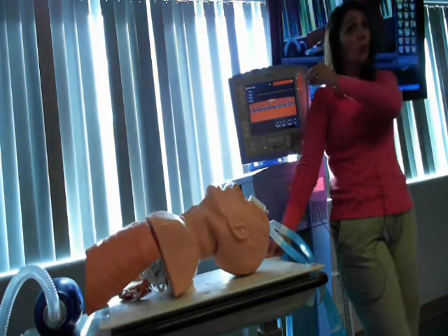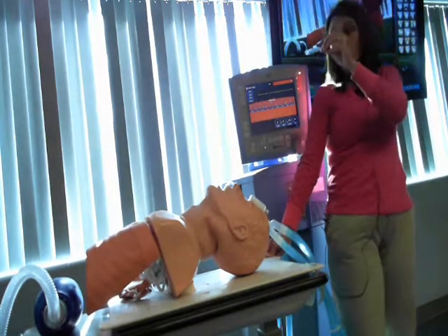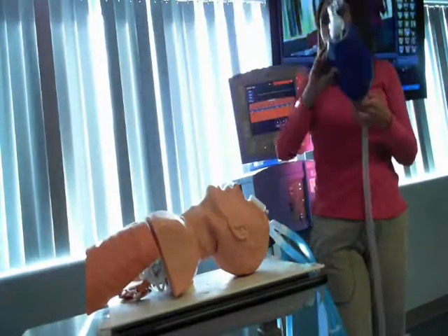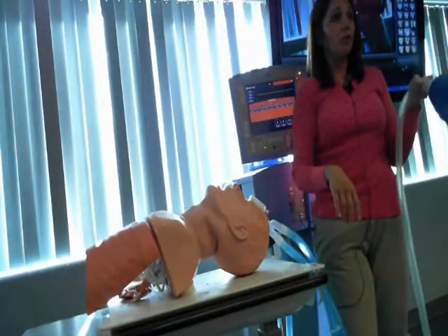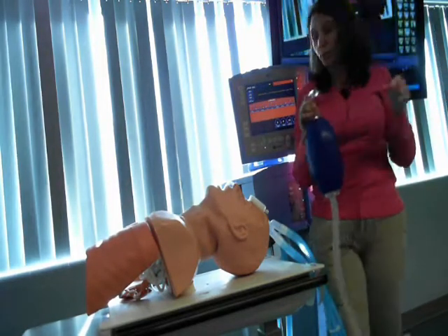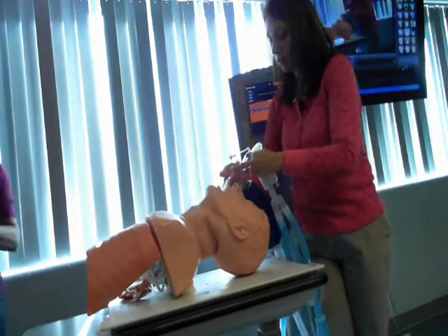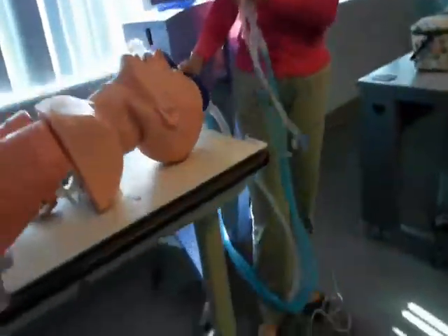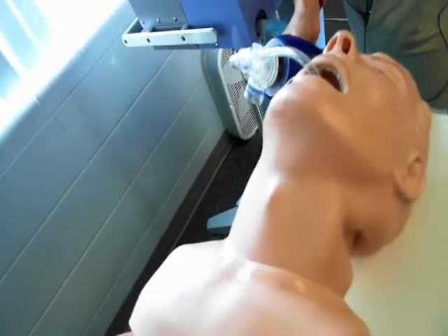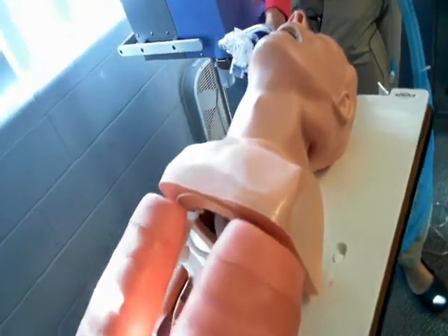So if you don't know what to do, don't focus on this piece of equipment. You focus on that patient, and you get this ambu bag. Costs probably $50, which is pretty cheap in healthcare. And you hook it to 100% O2, you disconnect from that vent, you ambu bag. What do you need to do now? Do what? Squeeze it? Yeah?